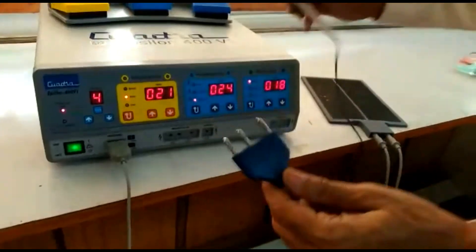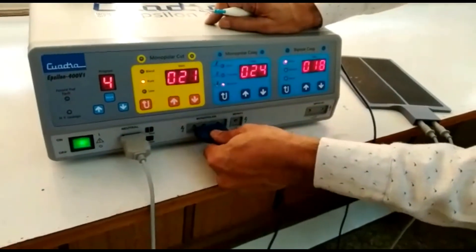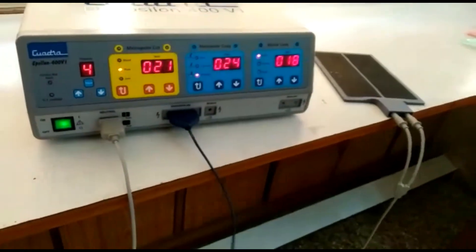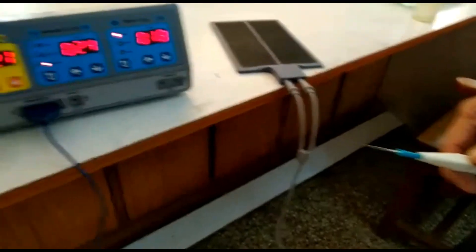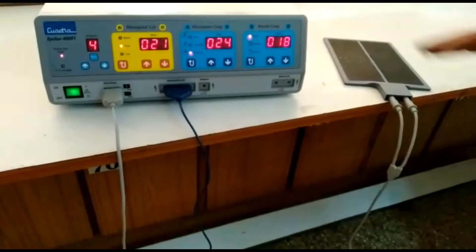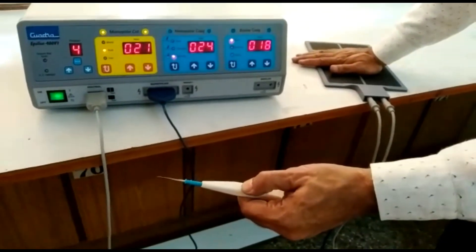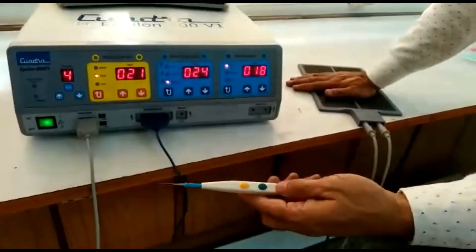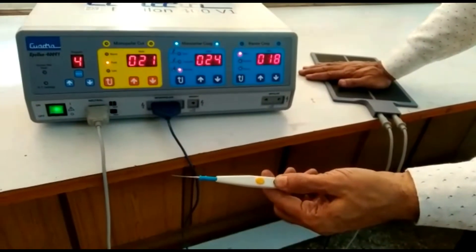The disposable monopolar hand pencil provided with the machine looks like this, and it is inserted into the monopolar socket like this. Activation rules are the same for the hand pencil as for the foot switch. If contact is not sufficient you will get an alarm but no activation. If the patient plate contact is sufficient and the fault blinking is gone, you can see output activation for both monopolar coagulation and monopolar cut.